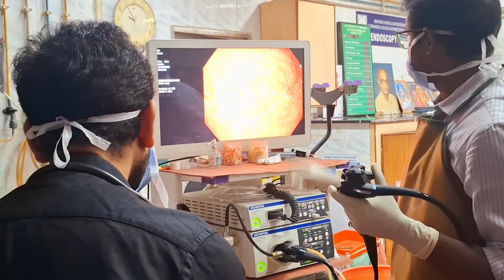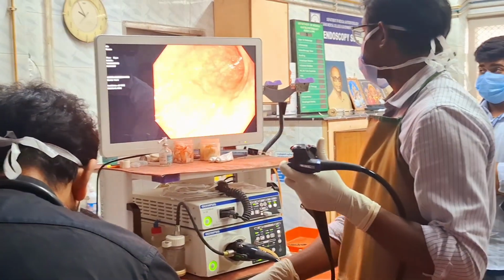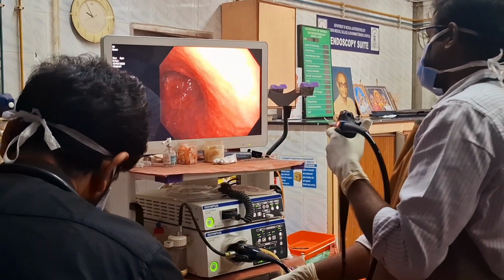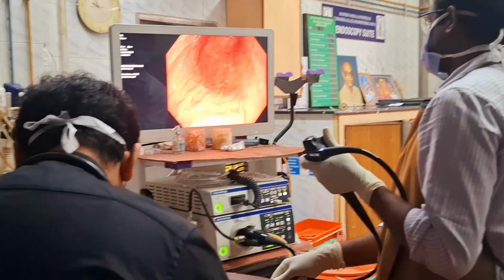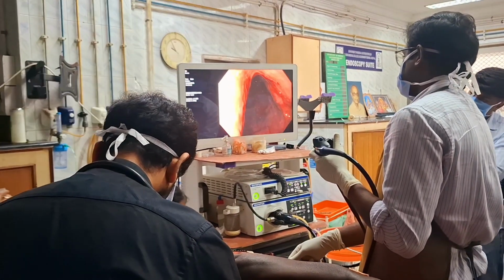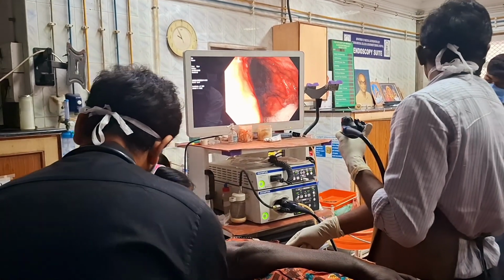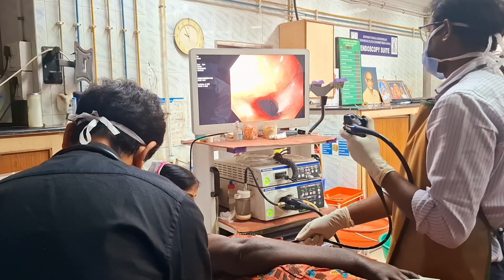Atrophic gastritis. So now when I come up, you can say what structure is this. Which part of it? So this is a rugal fold, which is in the greater curvature. Opposite is lesser curvature.